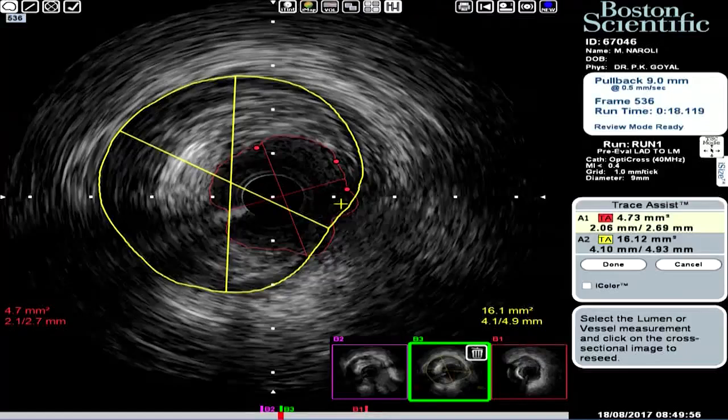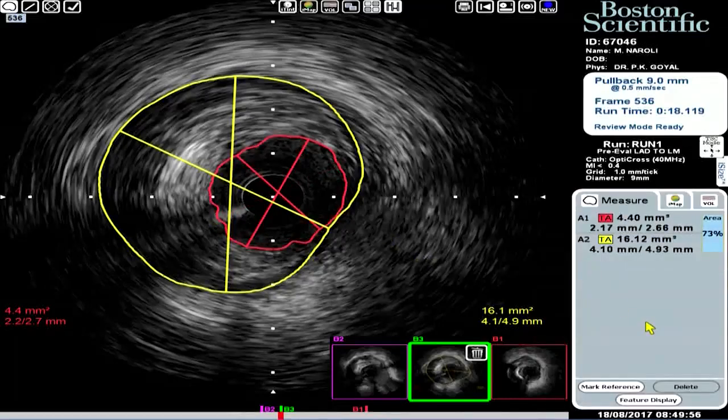The one other thing I would say for the other interventionists here is that I know cost is an issue, but I think if we're treating left main, it's imperative that you IVUS, because we're comparing ourselves to a surgical LIMA, which has excellent results. We have to optimize. I totally believe in that.